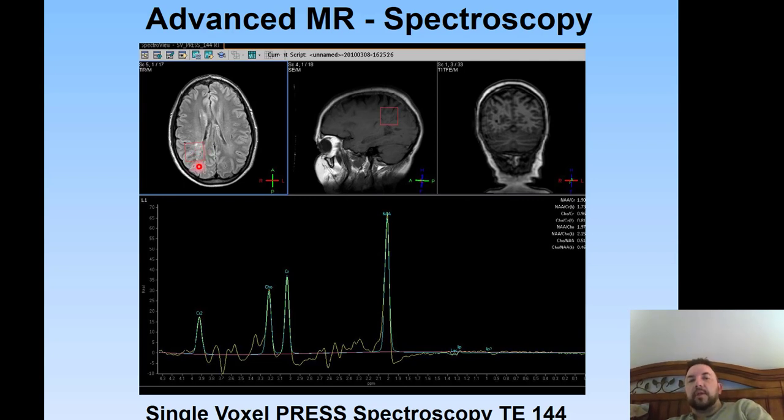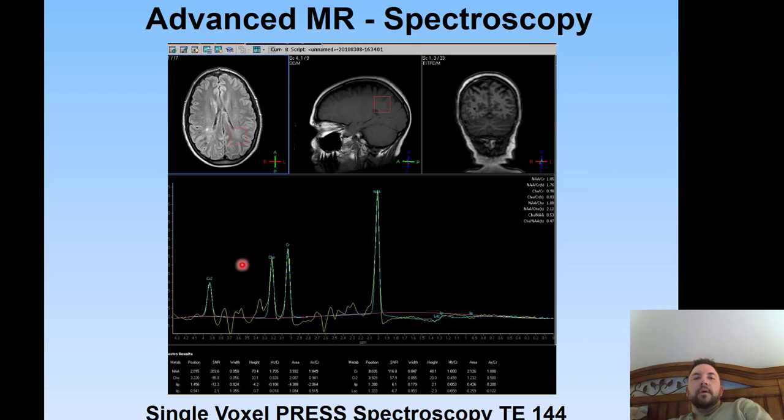Patient that we follow, a kid actually, they were looking to do a biopsy. The parents did some research and they wanted to do spectroscopy instead of having to put a needle in their child's head, basically, right? Non-invasive method. What do we find? The amount of choline compared to the amount of NAA. Perfect hunter's angle. No need for anything that's malignant because the amount of NAA, the normal tissue, is far greater than the amount of choline. There is no choline spike. Hunter's angle. Contralateral side, same thing. Normal hunter's angle. That positive find in that area that was suspicious is confirmed as being benign, just very simply by a non-invasive method of imaging.